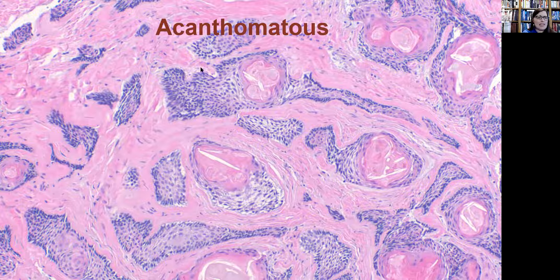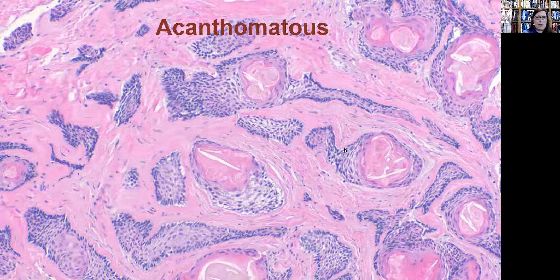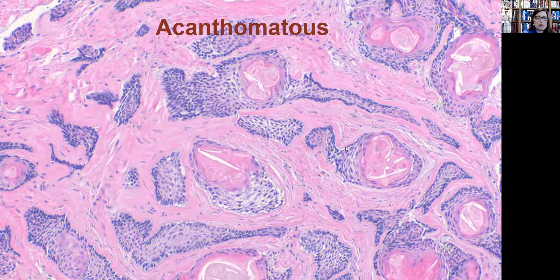Another variant is the acanthomatous variant. Here we see peripheral palisading at the edges of the island but also keratin pearls or squamoid change in the center of these islands. This represents about 12% of ameloblastomas. We also see a fibrocellular stroma in this variant.